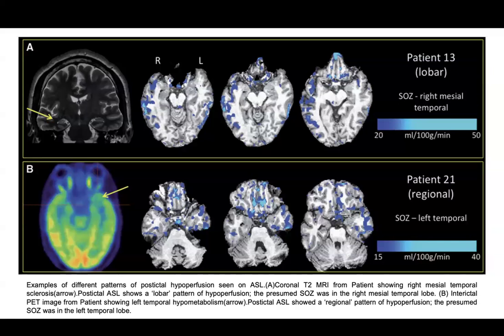What is this hypoperfusion? Is it a statistical map? This brain map is very important. It's mapping the threshold, not the perfusion. Okay, go to the article and know what is SPM.